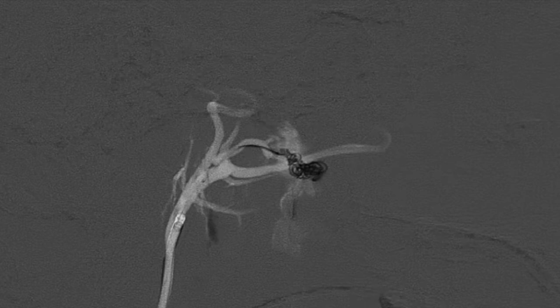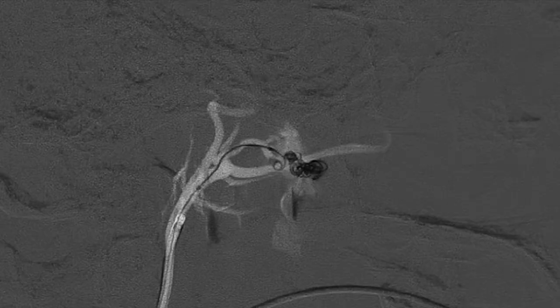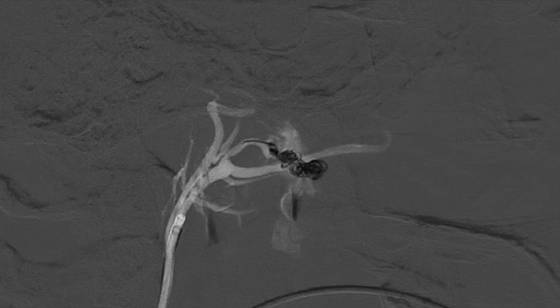A repeat angiogram was performed following placement of a few coils, which still demonstrated persistent fistula and opacification of the pterygoid venous plexus. We continued to proceed with the coil embolization. Once it was clear that we had achieved coil embolization of the actual arteriovenous connection, we then decided to proceed with embolization using a liquid embolic agent.